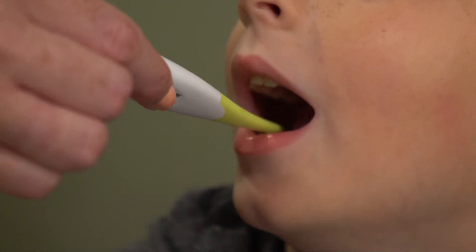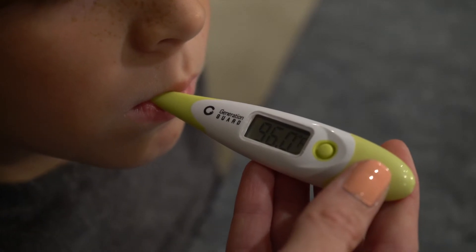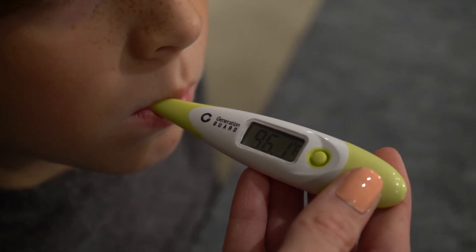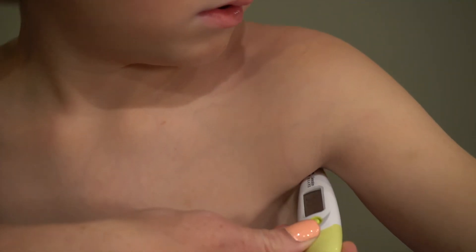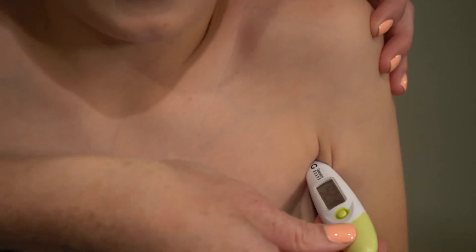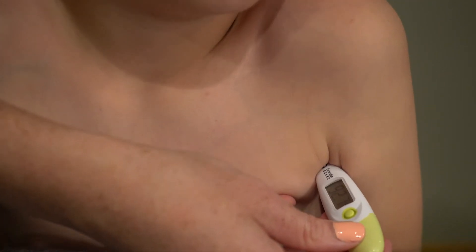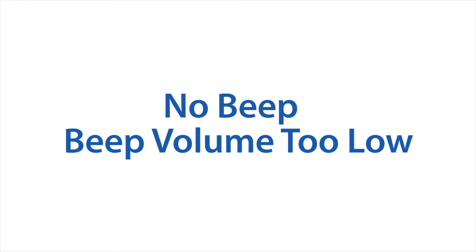The MT-4320 thermometer reads most rapidly and effectively when used orally. Place it deep under your tongue towards the back and center, and close your lips. The reading usually takes 10 to 15 seconds. For infants and small children, an armpit reading is more comfortable, however it will register a lower and less accurate reading than when done orally. A rectal reading will be most accurate.